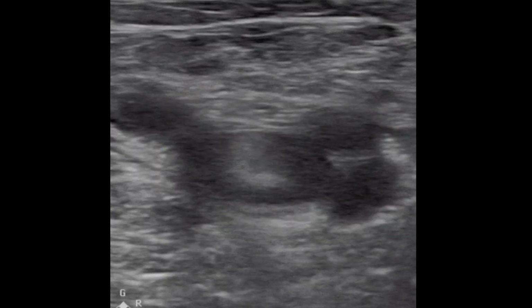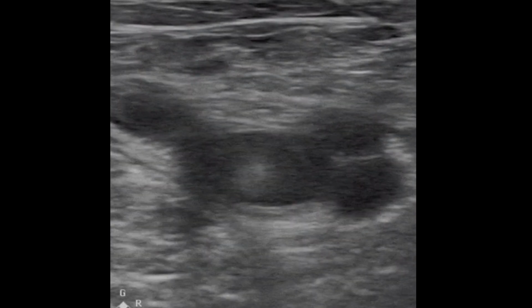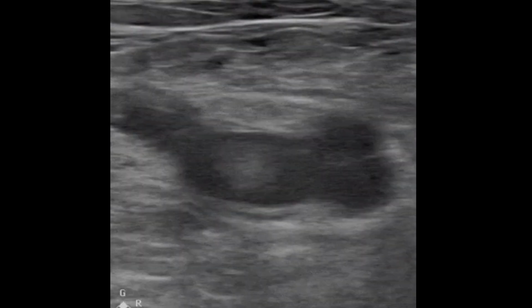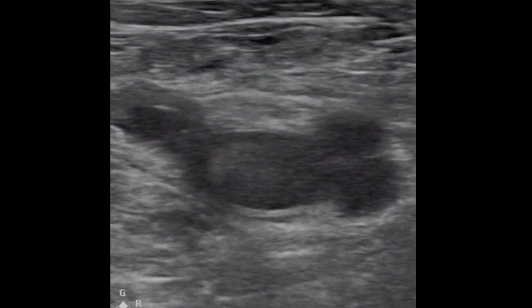Okay, so that's a thrombus dancing around there in the vein. The other day we had a patient with a large thrombus swirling around in an RV. So then you don't need any further investigations. This patient has got a PE.